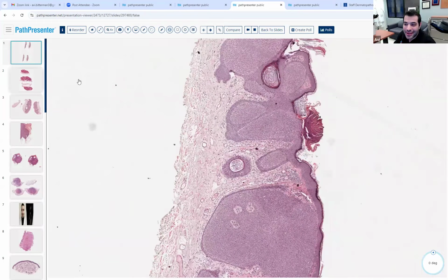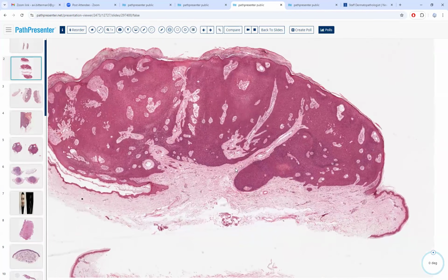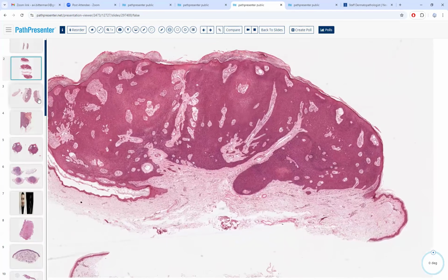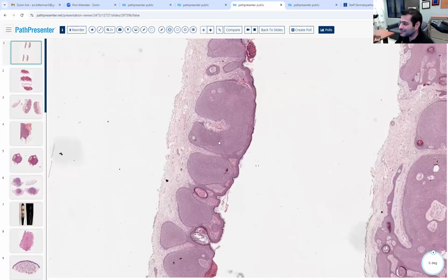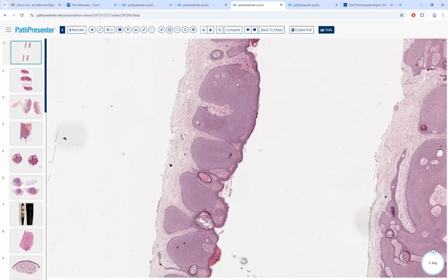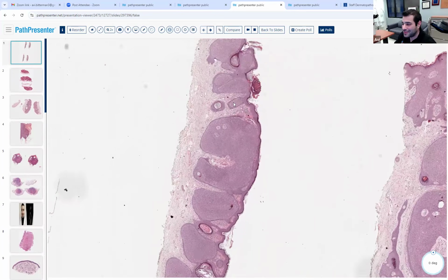If that looks like a poroma, what does this look like? Is this a hydroacanthoma simplex? This or this? And what's the difference? I think that the poroma, honestly, I'm not sure. So, does anyone know?